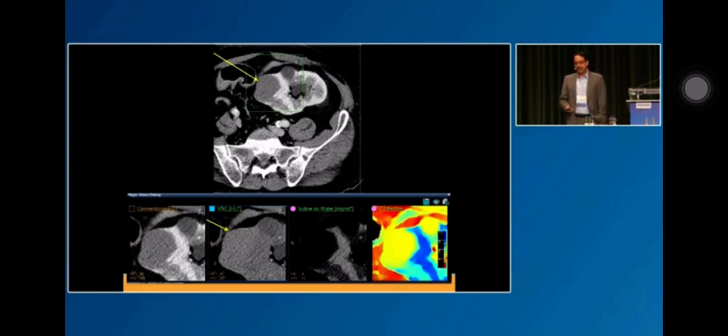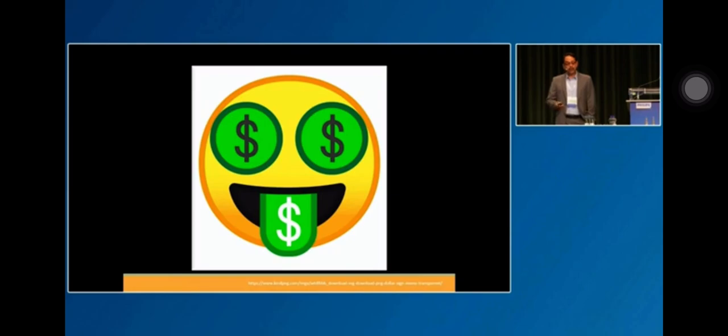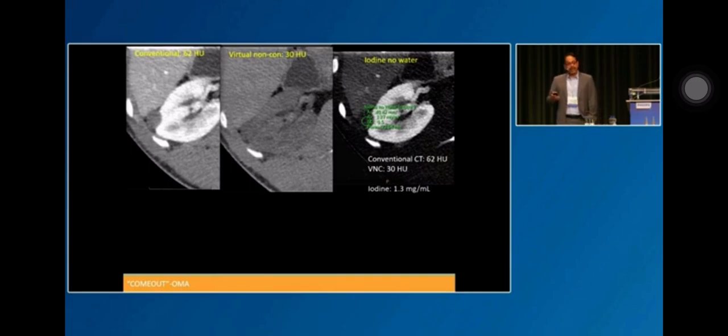When administrators see this ability to reduce follow-up workup exams, they see dollar signs. But to me, that is not the biggest advantage of spectral CT for incidental lesions. For me, the biggest advantage is that it can expedite workup of suspicious lesions. As our clinicians and our patients are drowning in this tsunami of incidental lesions, you can find the ones that truly need to be expedited.